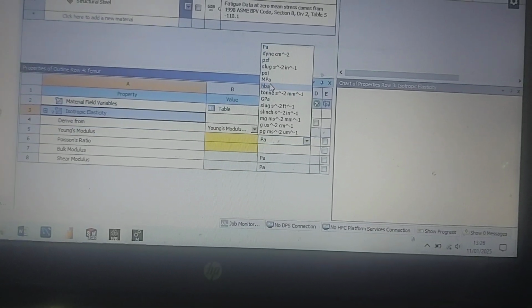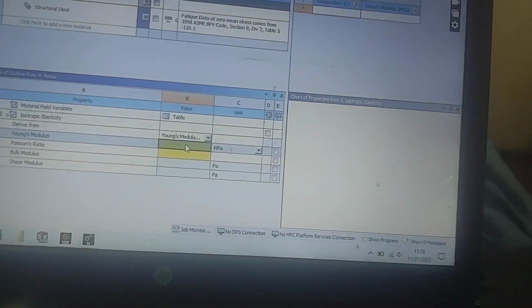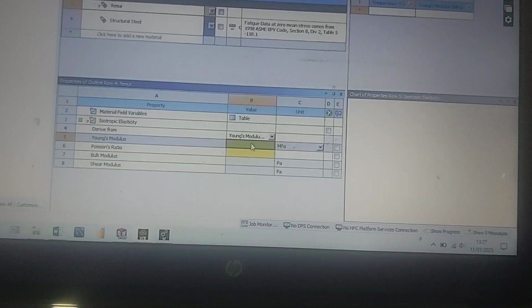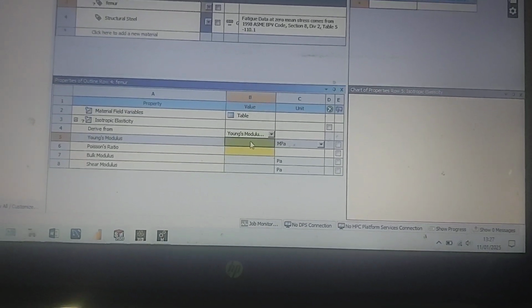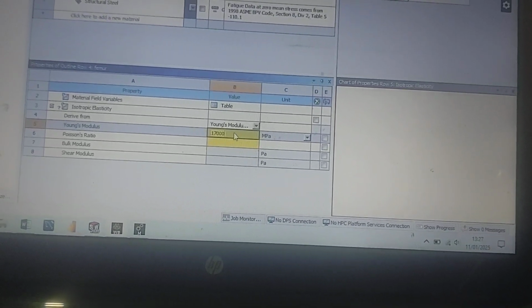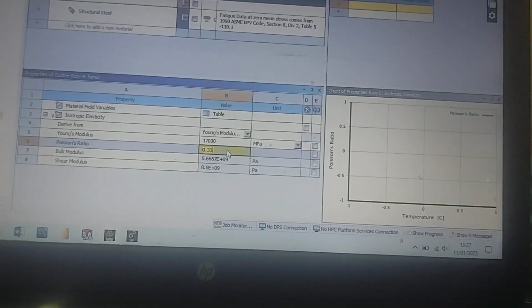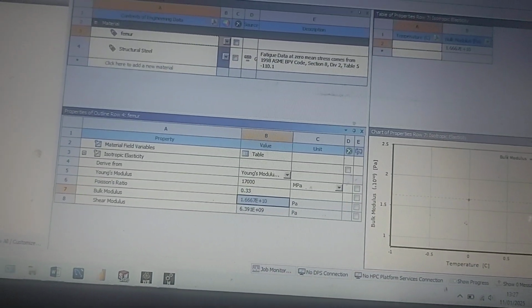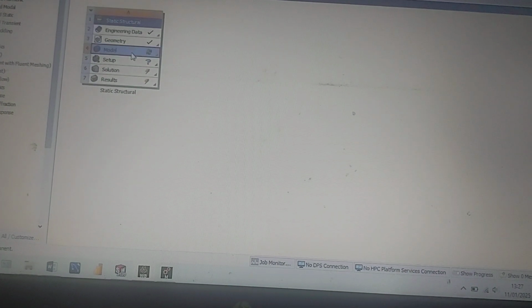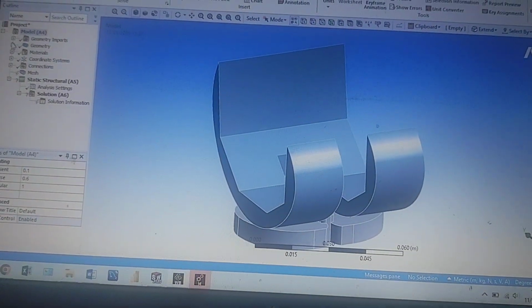Change it to megapascal, because properties are usually in megapascal. For Young's modulus add 17,000, or you can look it up in Google Chrome: what are the properties of biomaterial for femur bone or any other implant? For Poisson's ratio I arbitrarily added 0.33. Then come to this window, double click on model, and the model is opening. It will take a few seconds.